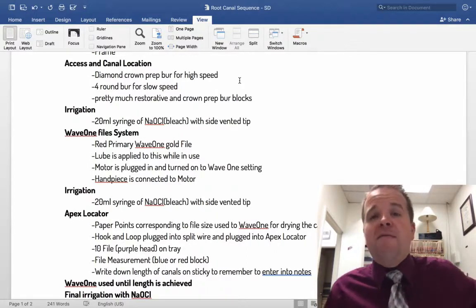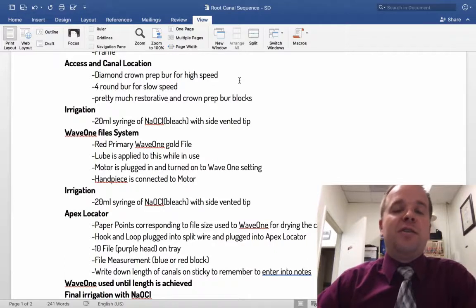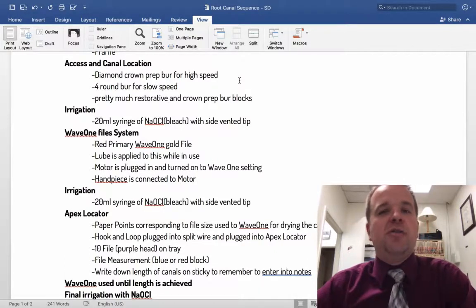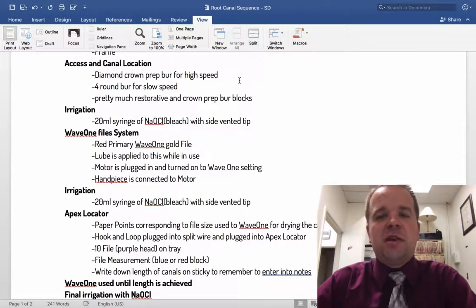Some people will use a 557, but you'll also have a 4-round burr in the slow speed. And during this time, you'll be suctioning just like you would for a regular filling. And then they'll clean it out and make sure everything's good and clean. And you'll do a lot of rinsing and drying with the air water syringe so that they can see the canals.